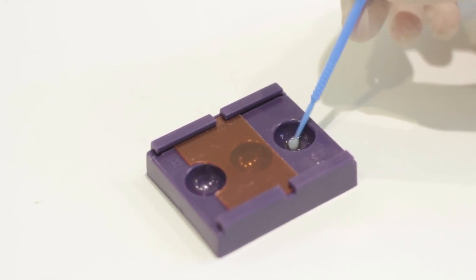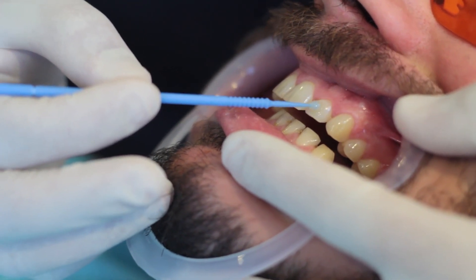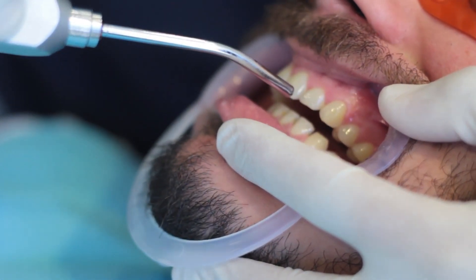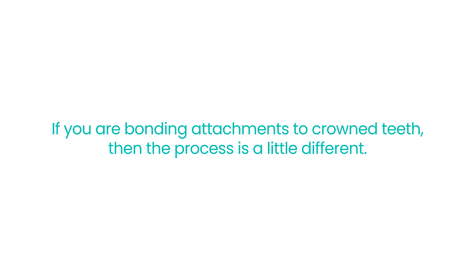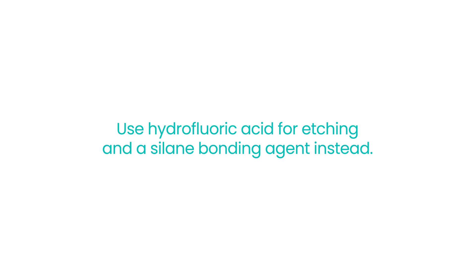Then, we prepare and apply the primary adhesive material to bond the attachment to the tooth surface. Next, gently dry the bonding agent after application and light cure as directed by the manufacturer. If you are bonding attachments to crown teeth, the process is a little different — use hydrofluoric acid for etching and a silane bonding agent instead.